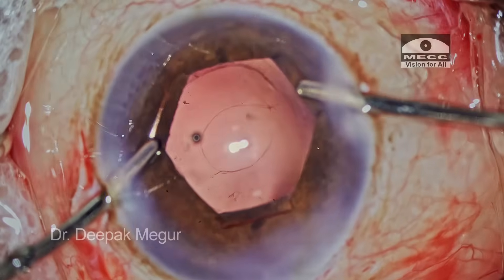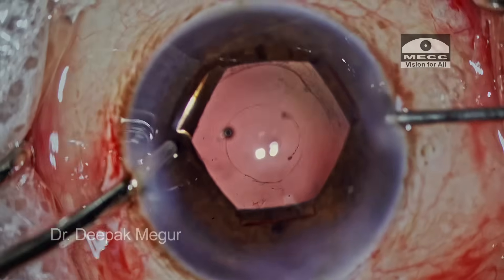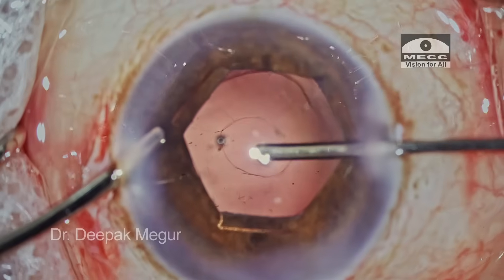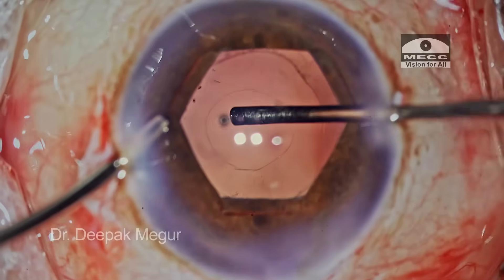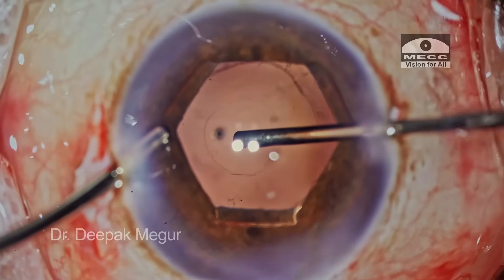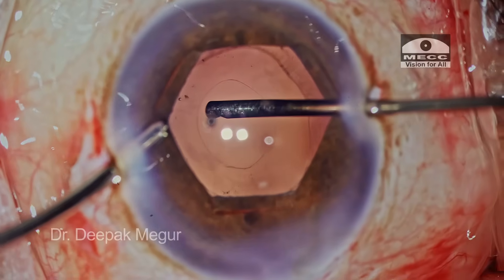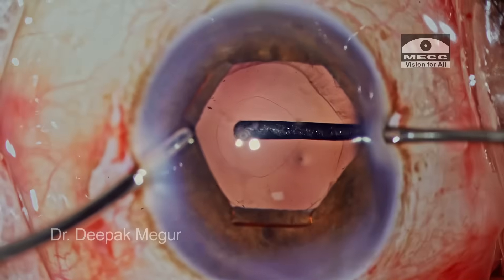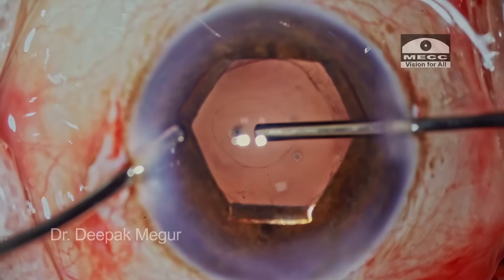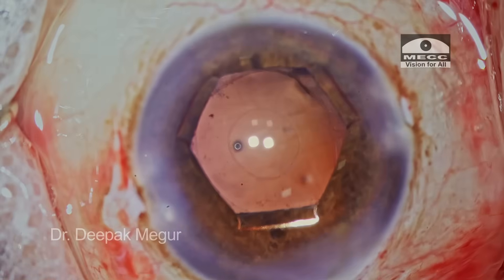Before going in to implant the lens, I want to do the vitrectomy a little bit more — I want to be sure there is no vitreous around the posterior capsule tear. Just holding the vitrector still, cutting and aspirating. It looks like vitreous is totally taken care of and now is the time to implant the lens.